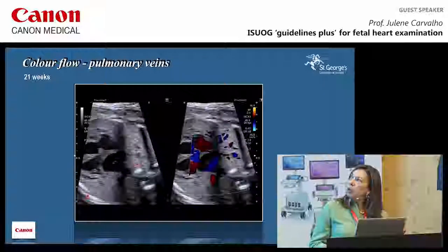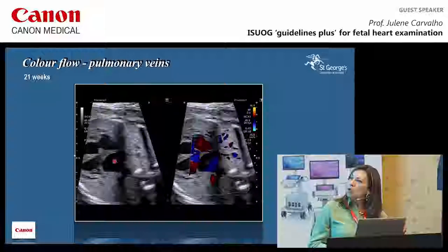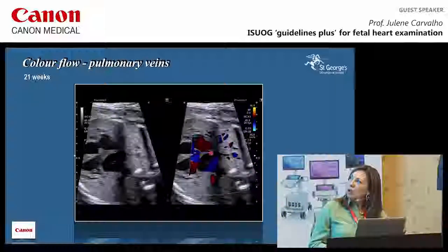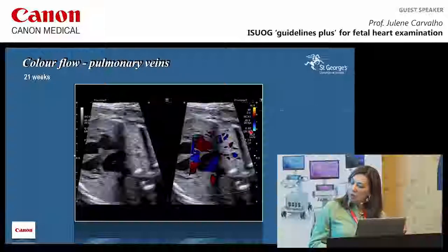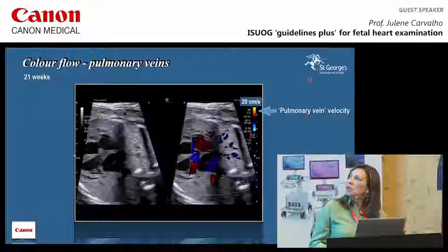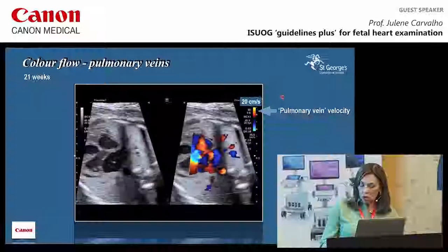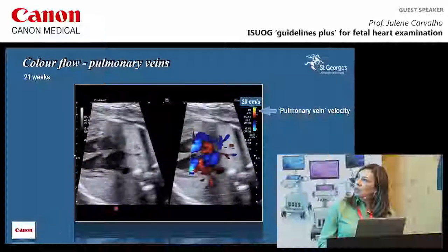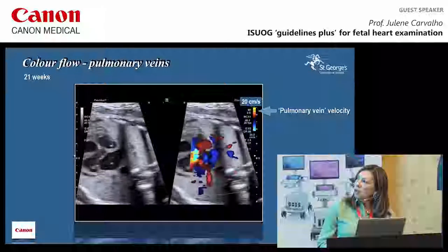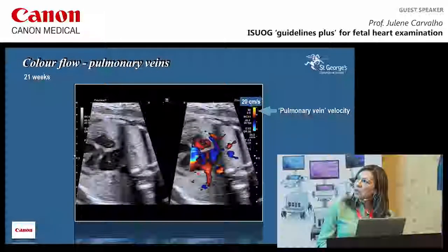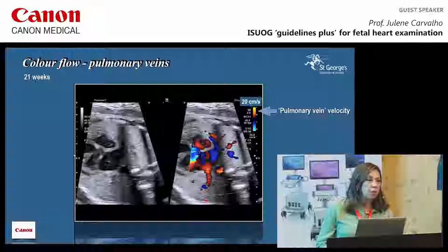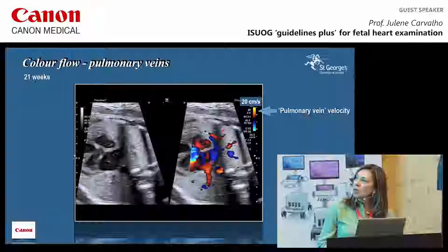When looking at pulmonary veins, shown here in a dual display, you have the left atrium and pulmonary veins coming from the left and right lungs in different colors. The velocity is much lower — about 20 centimeters per second in mid-gestation. You can see a nice display of the pulmonary veins, with flow from the left lung coming in red and the right lung in blue.